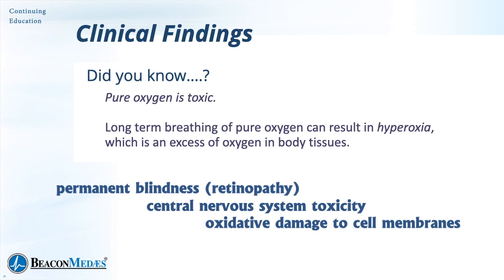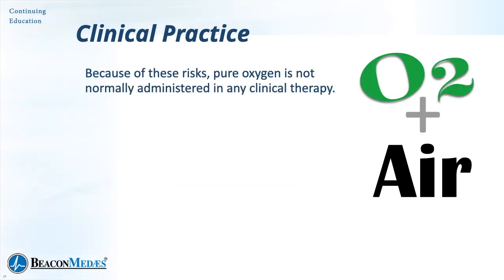That's why we don't want to administer pure oxygen. We always want to mix oxygen with air. Pure oxygen is normally not administered in any clinical therapy. The only time you would typically see pure oxygen used is in resuscitation.